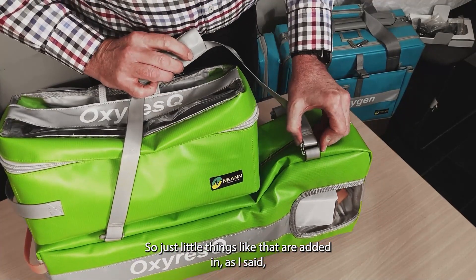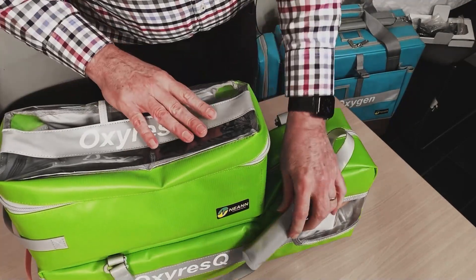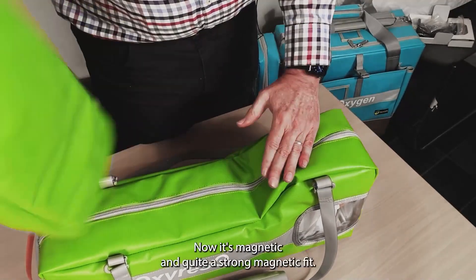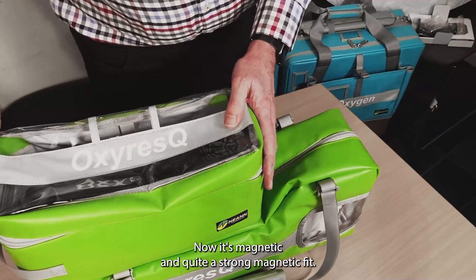They even feature C-clip handles so you can remove and replace the handles if they ever became damaged. The attachment between the two used to be Velcro, but now it's magnetic — and quite a strong magnetic fit.